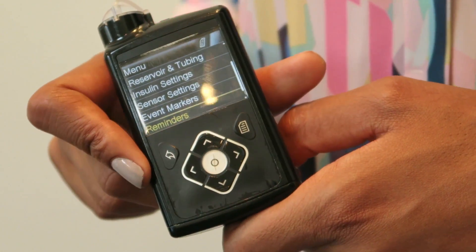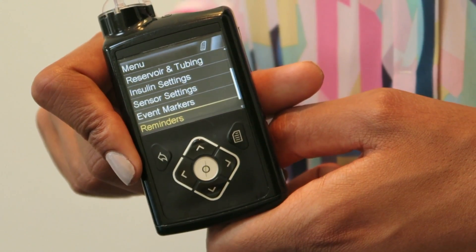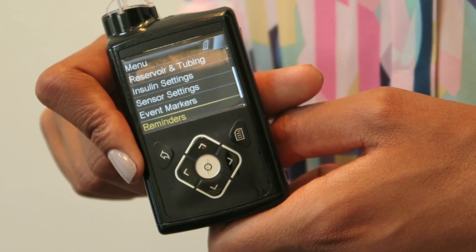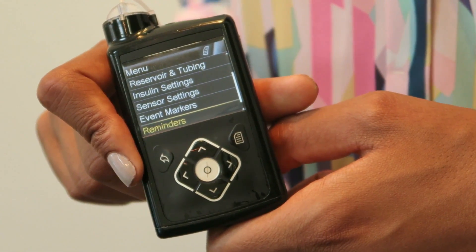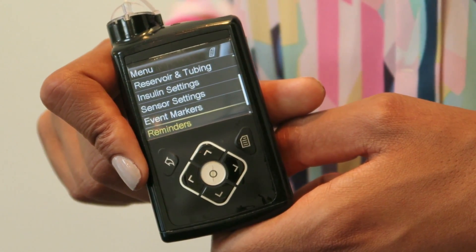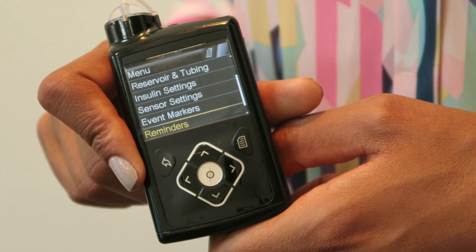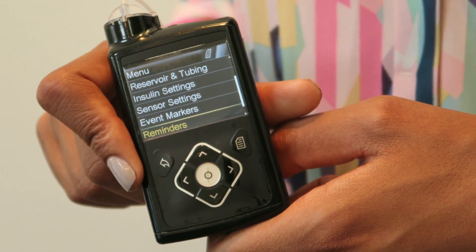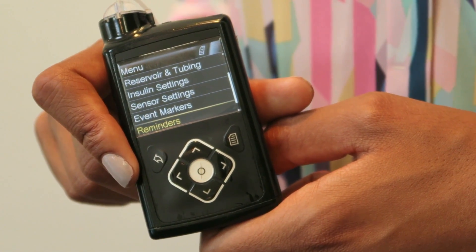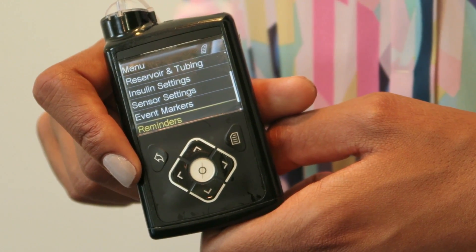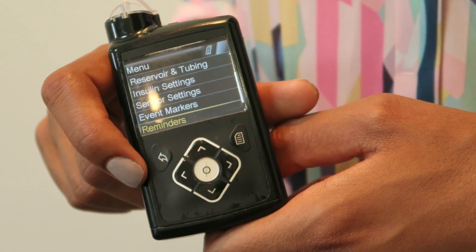Then you've got reminders, so if you wanted to remember to test after a high or a low blood glucose reading, this option gives you a reminder on the pump to do that.